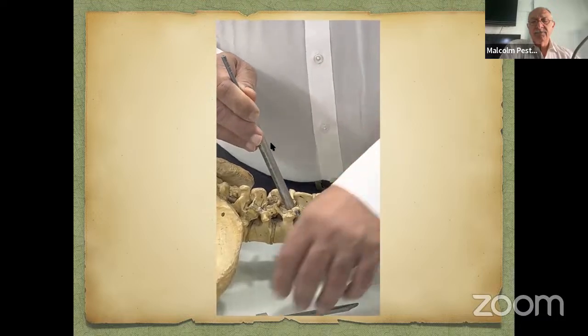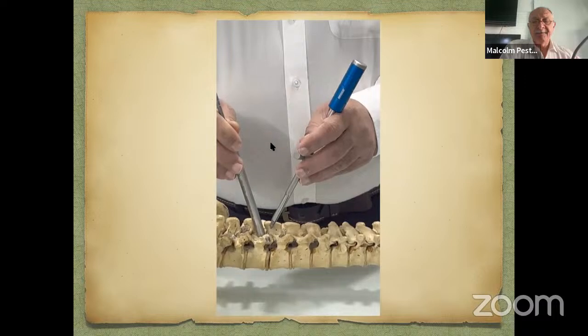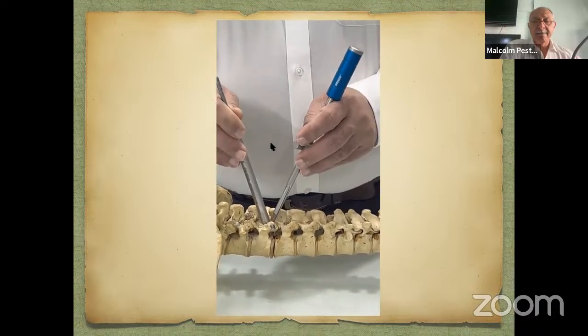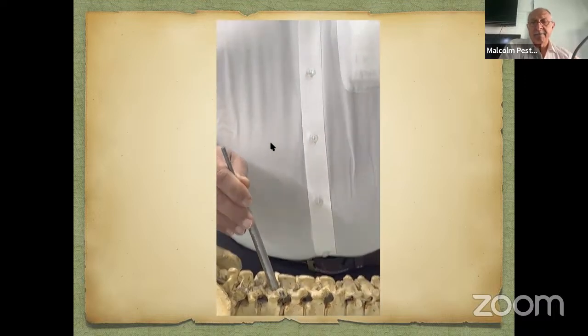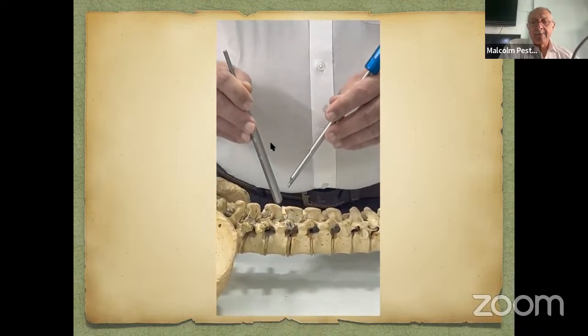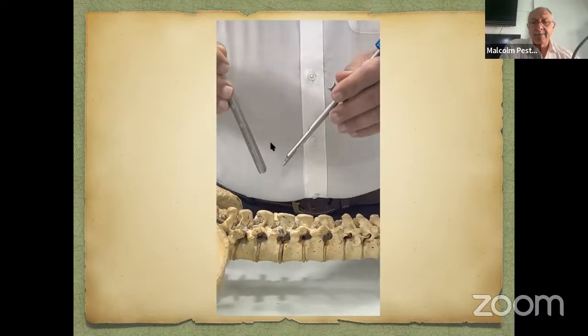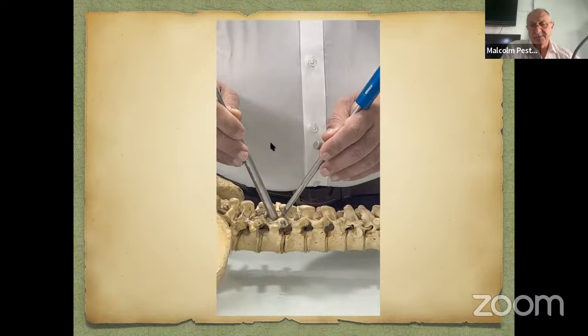Having done that, assume that this is a scope in my hand. I take the next portal coming from above the pedicle and then targeting the spinolaminar junction. I'm showing everything to you on your side so that you can appreciate it. In reality, I'll be doing it on my side, but because there is a bone in between, you won't be able to appreciate it. So I'm showing you this on the contralateral side.